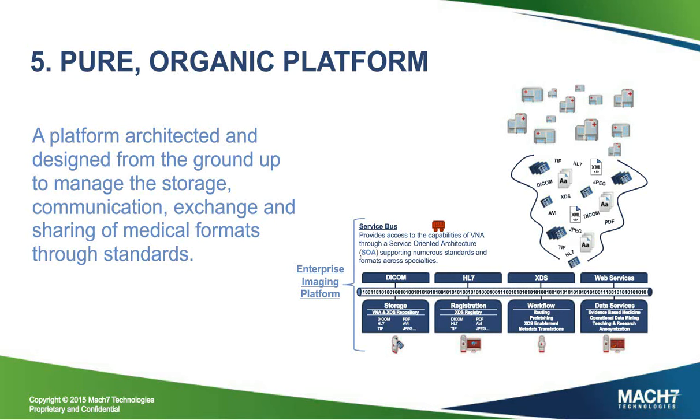How does that archive, how does that platform, store a DICOM study? Does it wrap it? Does it store it in its native format? There may be good reasons for one or the other, but having the flexibility to have a platform that can store things in their native format, store things that are standards based, is important. And with that, Ronaldo and/or Boris, do you have any comments around that?